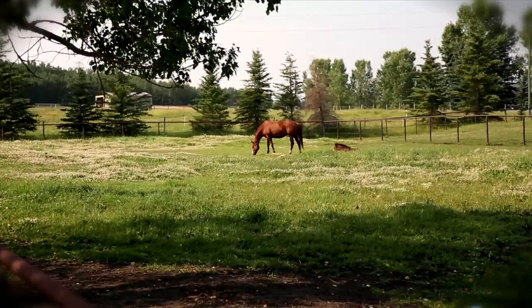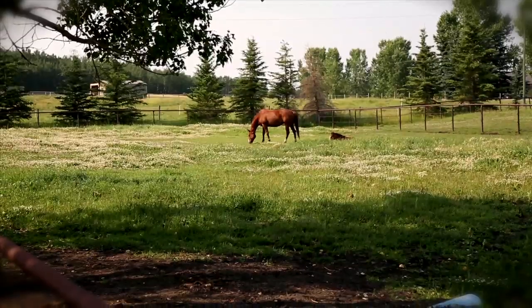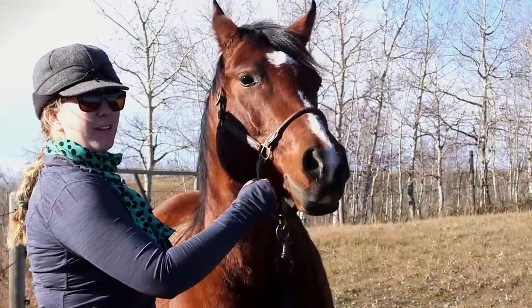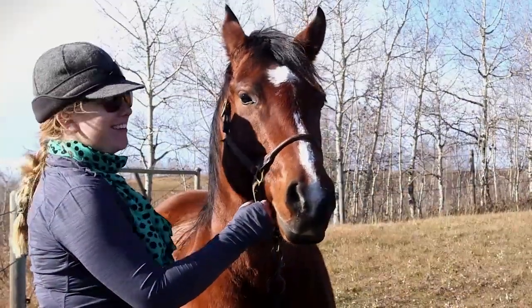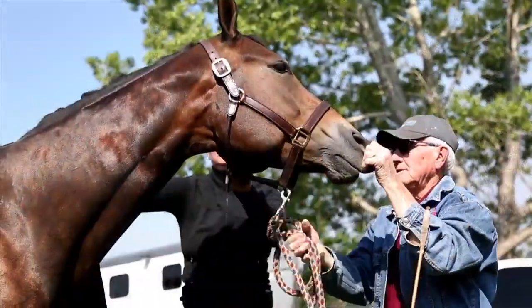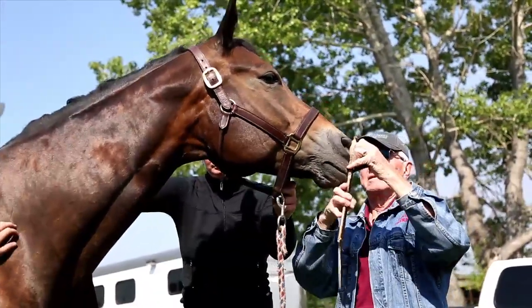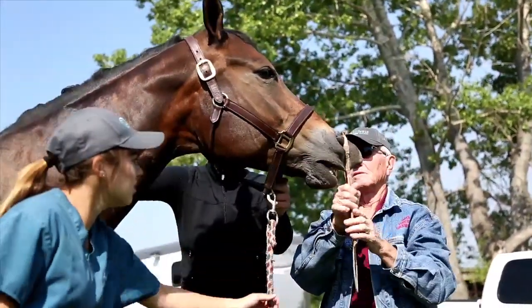Very few equines require chemical sedation, less than 0.001%, but it's important that your assistant or second handler is comfortable with some form of physical restraint if required. The occasional equine requires a shoulder or ear twitch in order to have the microchip safely and accurately implanted.